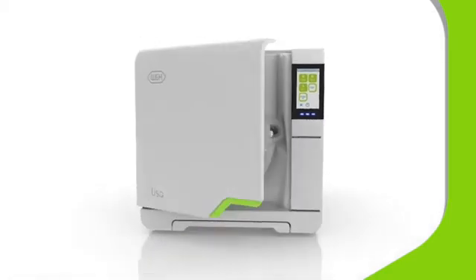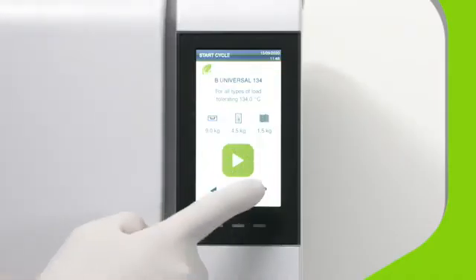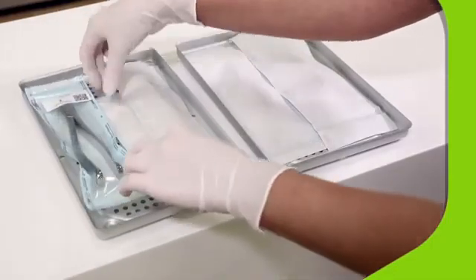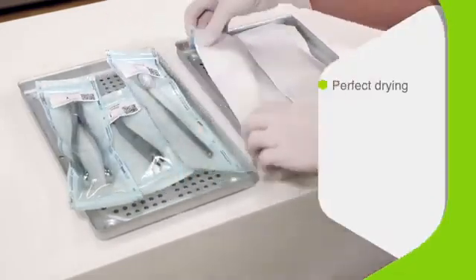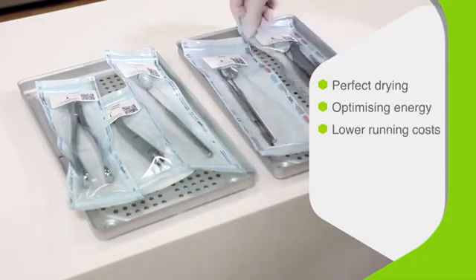To activate EcoDry Plus, simply choose from three type B vacuum sterilizing cycles for different compliance requirements and product types. From hand pieces to gowns, Lisa will automatically adapt the cycle time to be as short as possible, whilst maintaining perfect drying results, optimizing energy consumption, and lowering running costs.